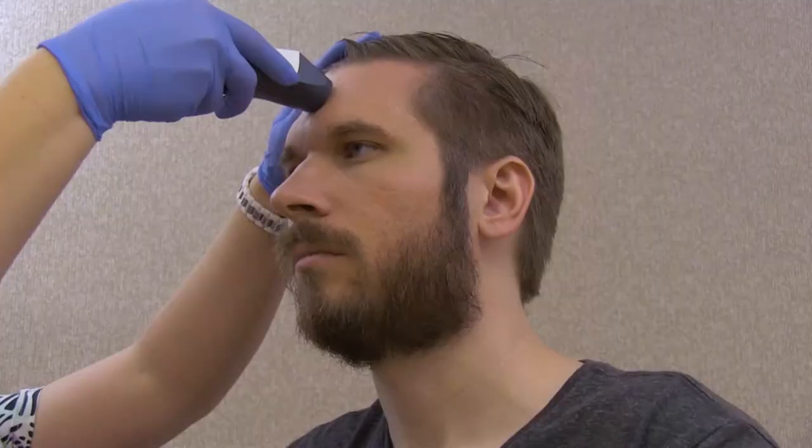Hold the probe flush against the skin on the center of the patient's forehead. Press the scan button and hold it while you slide the thermometer slowly across the forehead to the temple area hairline.